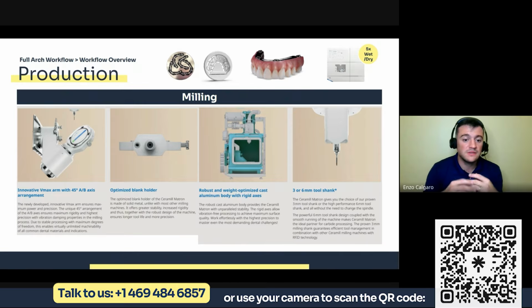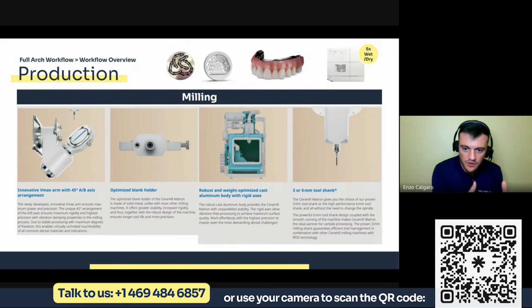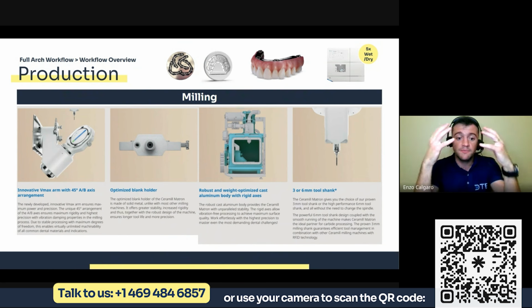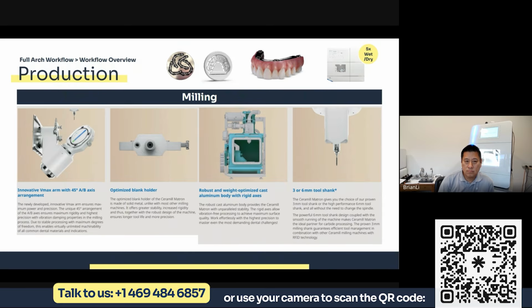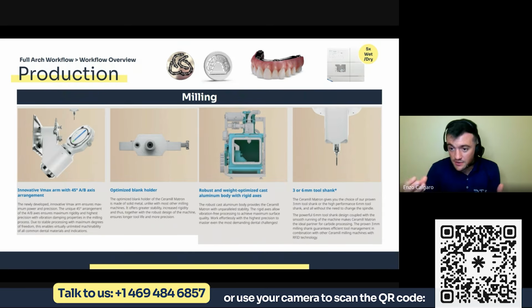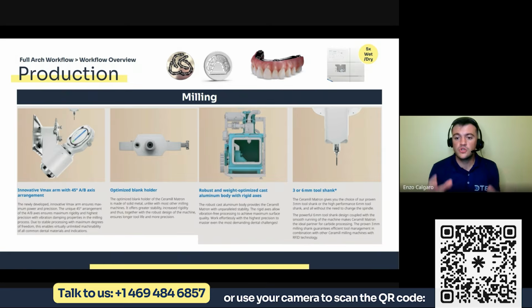You have a robust and weight optimized cast aluminum body with rigid axis. I'm not going to get too technical here, but just understand this mill was built for this. It has a one-piece body that, again, is focused on reducing vibration. And you have flexibility to change between 3 and 6 millimeter shank. So you have thicker burrs when you're milling titanium, and maybe you have another burr when you're milling zirconia. So again, all to control vibration.